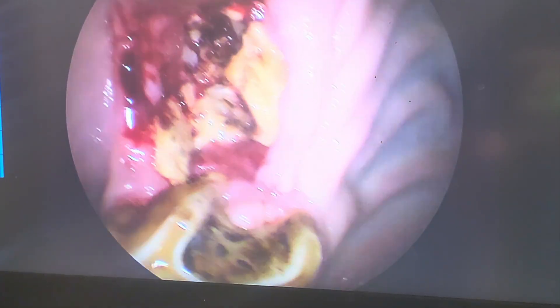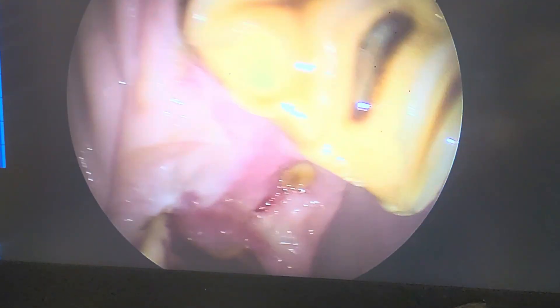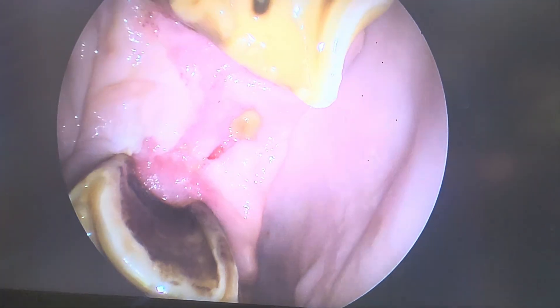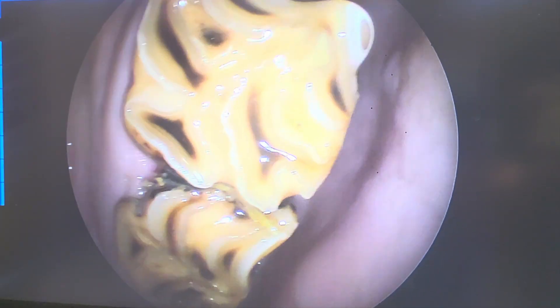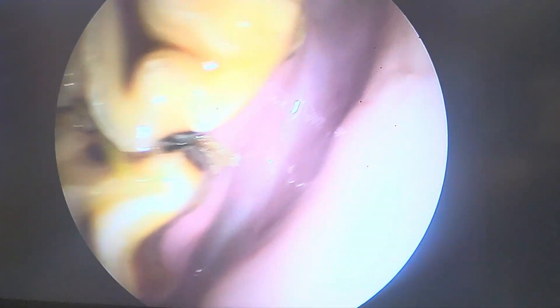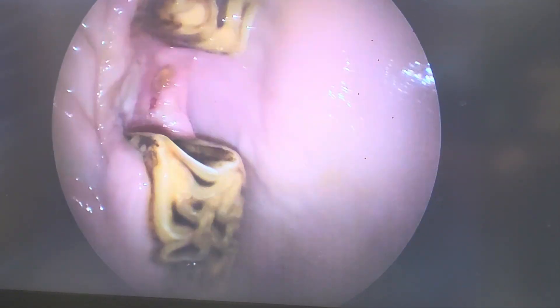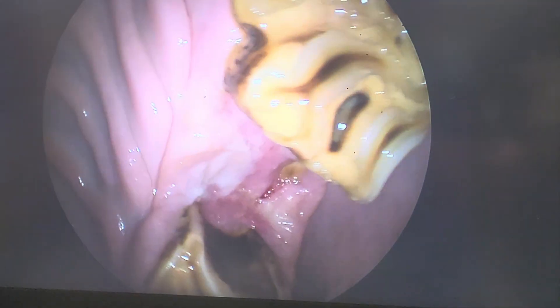That tooth on the CT looks like it's alive and okay. Now here we're on the other side — the horse's left side. Teeth six, seven, eight, nine — nine is broken, and we'll see a little draining track there. The number 10 is also rotated with mild periodontal disease; we can clean that out and keep an eye on it. We're going to go after this tooth here first, as this is going to be the hardest one — we can't really see it and it's very trapped as we know from the CT.